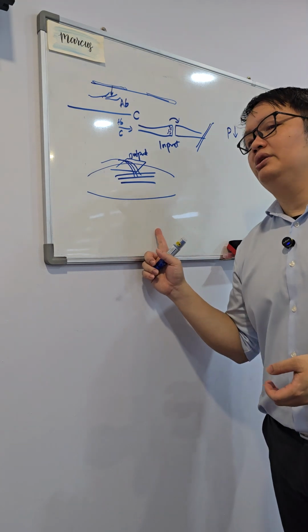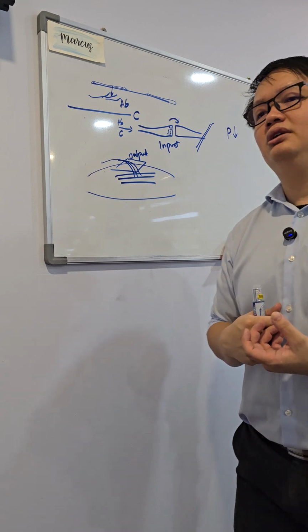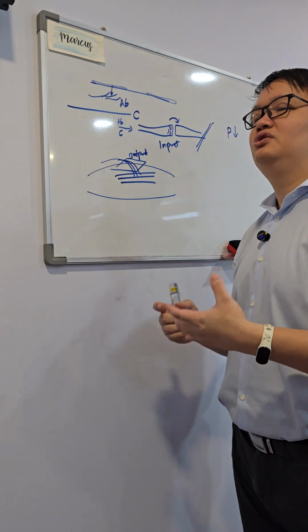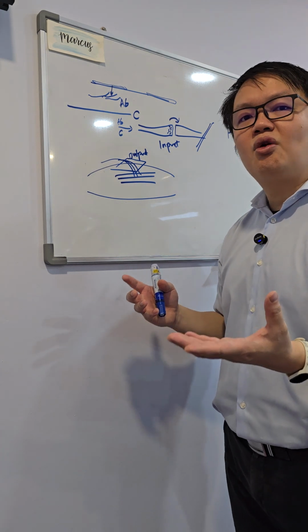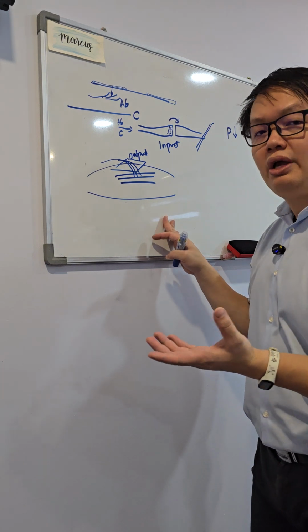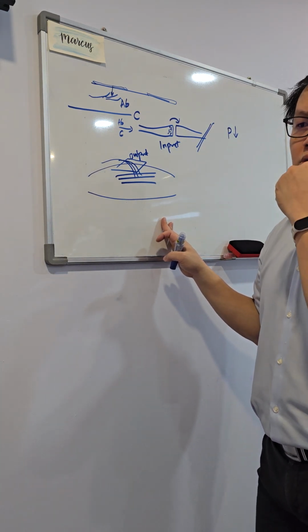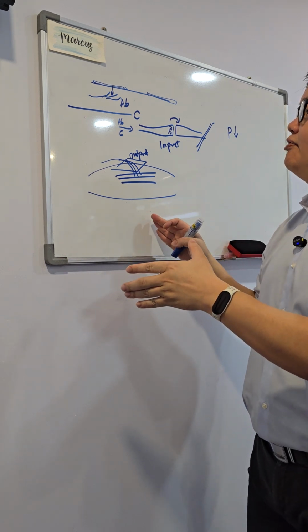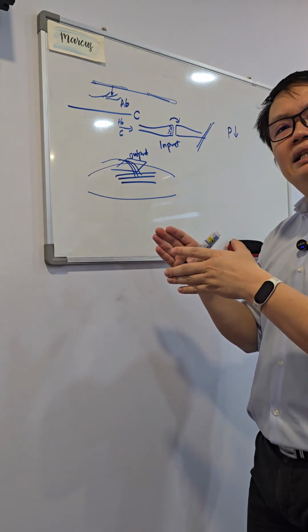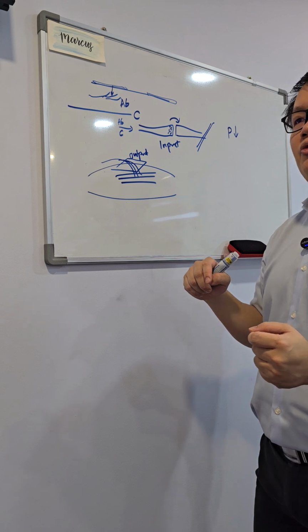Okay, second one is with this you also get pumping, so therefore you're getting sort of localized blood flow to the area, which then also generalizes a little bit of endorphin release around the local spot of this area, which also ends up leading to pain relief. Okay, so then this is where we are aiming for when I have a lot more neck guarding, stiffness type and feel, but they may not 100% be coming from a nerve.